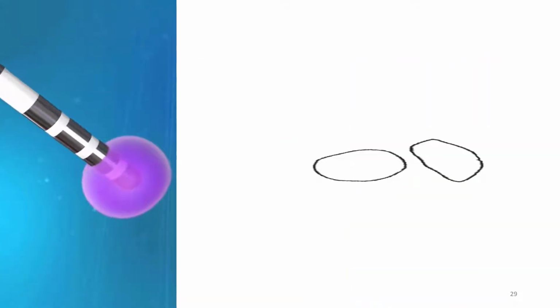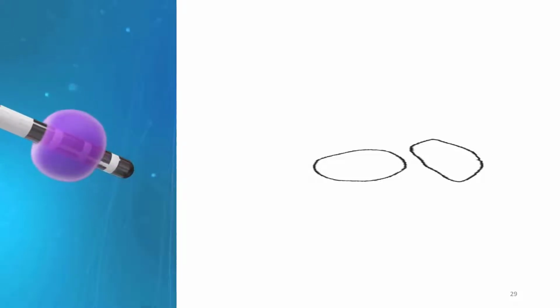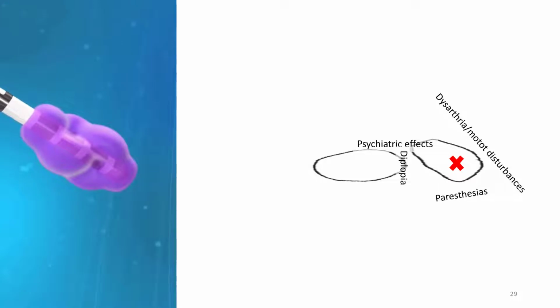We can shape the field of stimulation in various ways. The areas in the brain that we want to stimulate in order to reduce various pathological symptoms are not physically isolated entities. They are bordered and entangled in other structures where stimulation will cause unwanted side effects. We thus need to find stimulation settings with a stimulation field that will mainly encompass the intended target area while minimizing the spread outside of this.